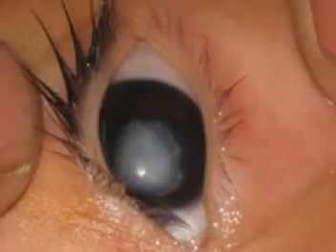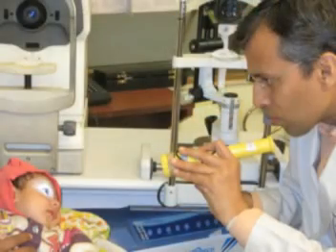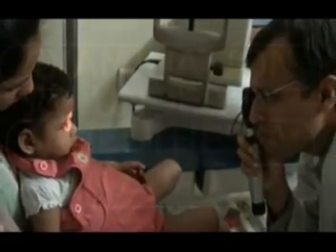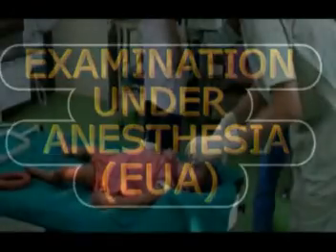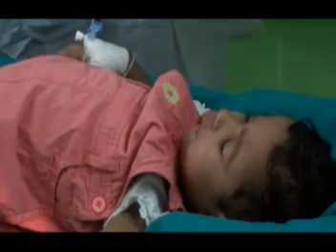A good examination before planning surgery is extremely crucial, and this may necessitate examination under anesthesia for these small children. Some children may allow examination without anesthesia if they are cooperative, and we should try to extract the maximum information in these examinations. EUA is often necessary for IOL power calculation as well as for other examinations of the eye.